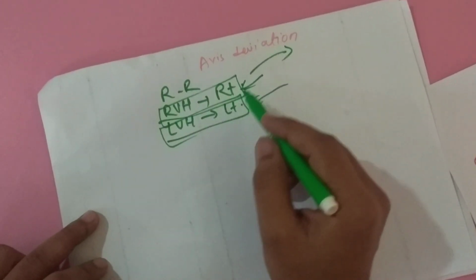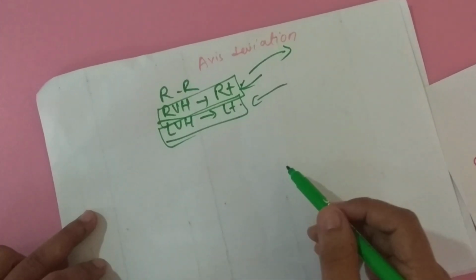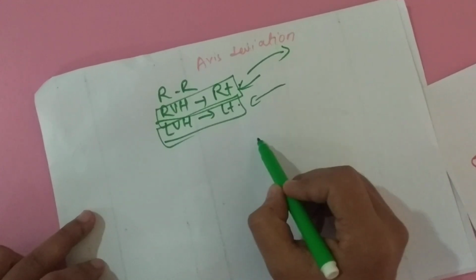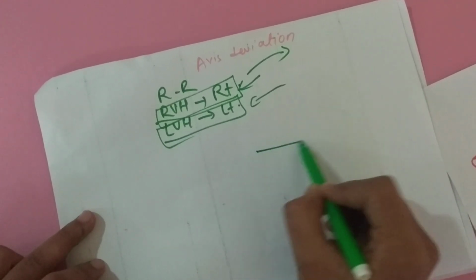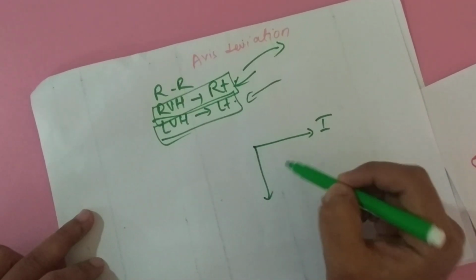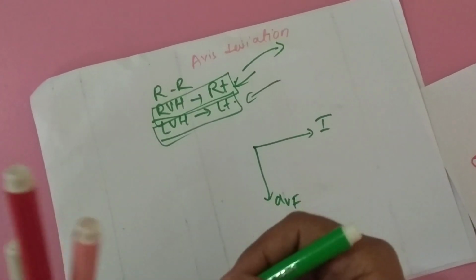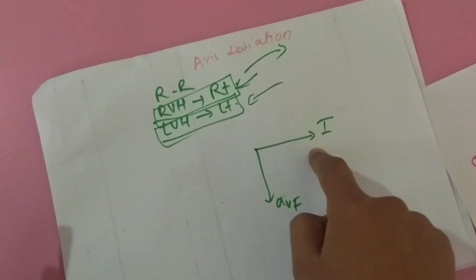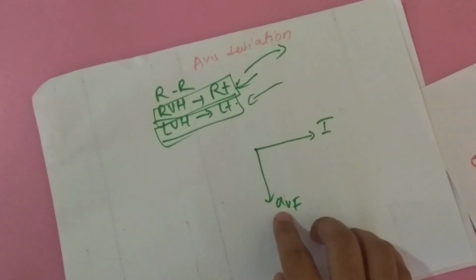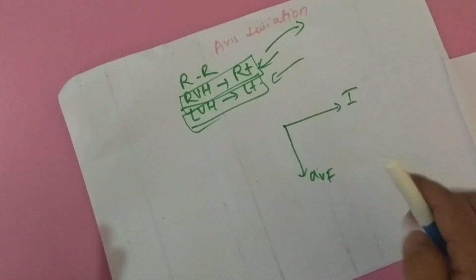Basic idea of how to find axis deviation, what I would like to give is what I usually do. Again, let's come to the basics. What I usually do is I take lead 1 and lead AVF generally, and I compare whether in lead 1 the resultant QRS complex is positive or negative, and I compare in lead AVF whether the resultant QRS complex is positive or negative.